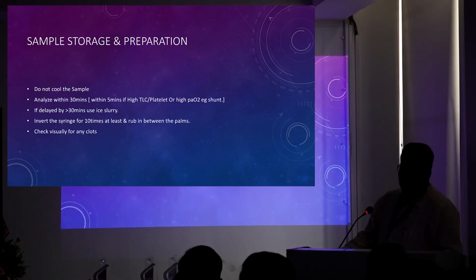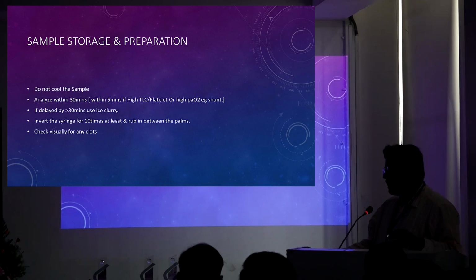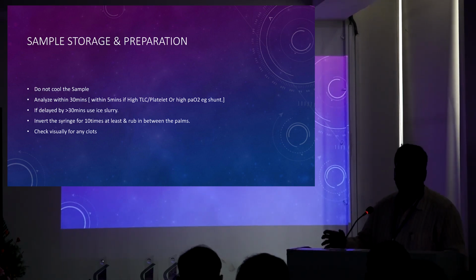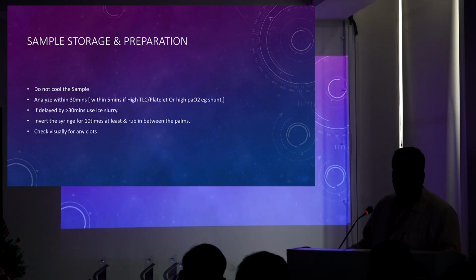Now, coming to sample storage and preparation, because this is as vital as sampling for the ABG. We do not recommend cooling the sample, because ABG is a point-of-care bedside test. If it is point-of-care and bedside, it doesn't require storage and transportation. So there should not be any time delay in the sample, and cooling is usually not recommended.